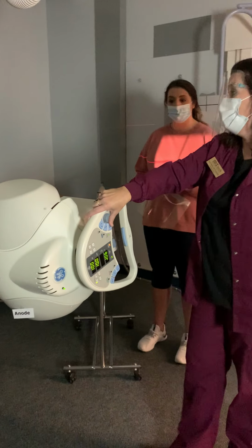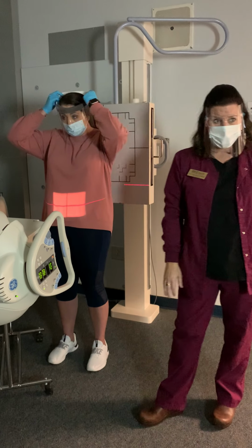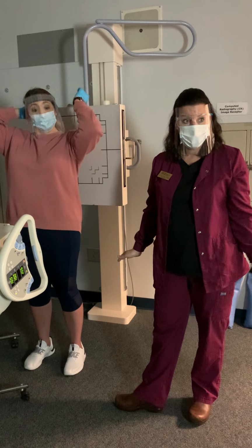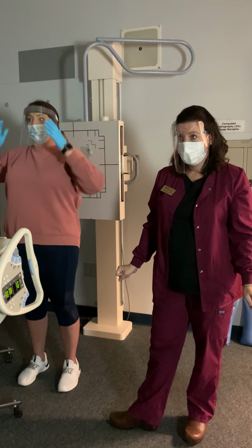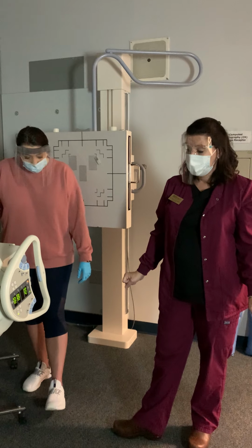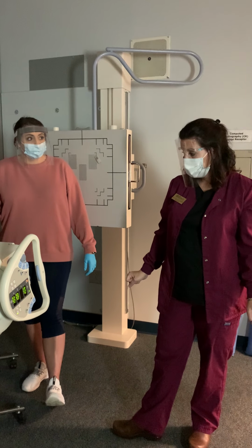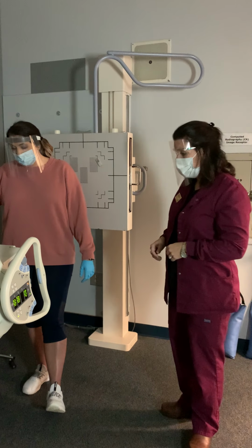All right, so any questions about AP and PA axial clavicle, or AP, PA clavicle? So for check-offs, do you want us just to angle it? So I'm doing the lordotics? Yes, we're not going to do lordotic for check-off. We're good? Okay. Don't forget that breathing, y'all. That's the biggest thing with clavicle. So let's practice this.